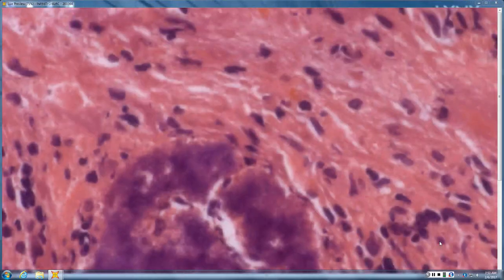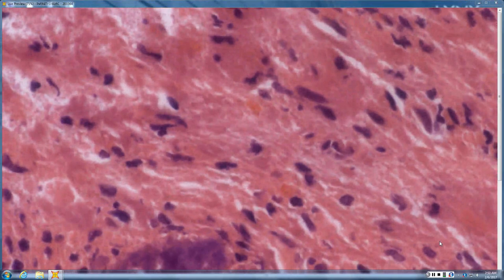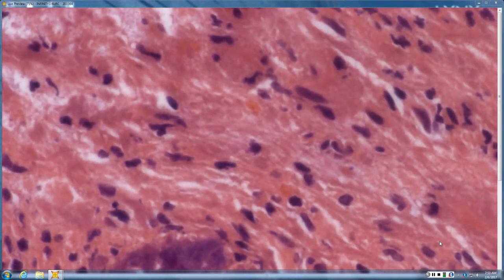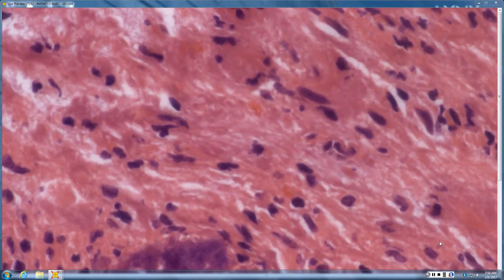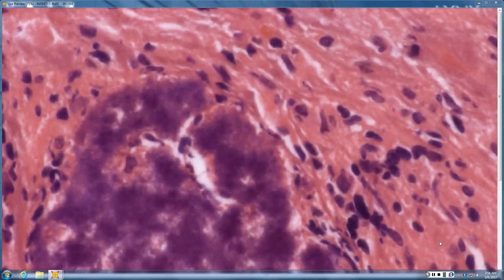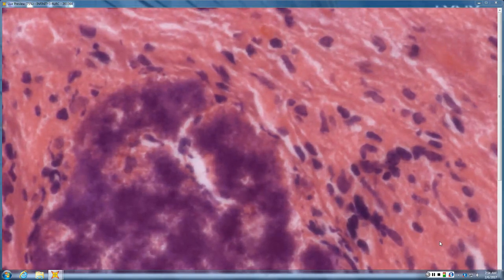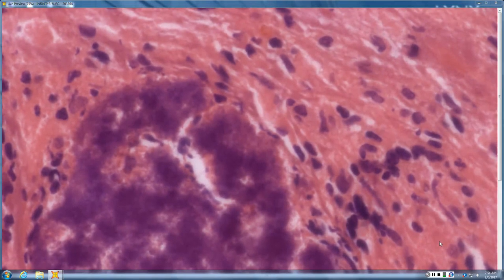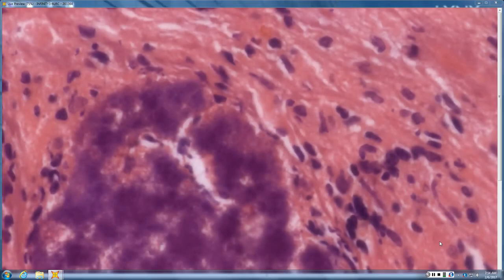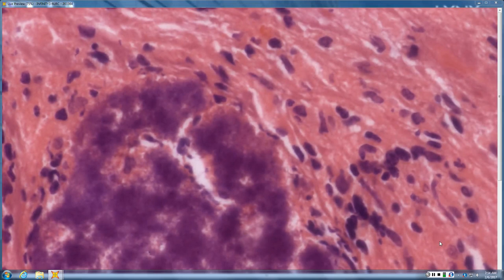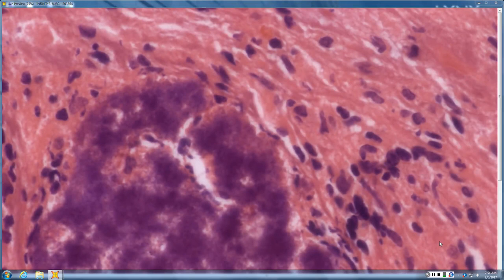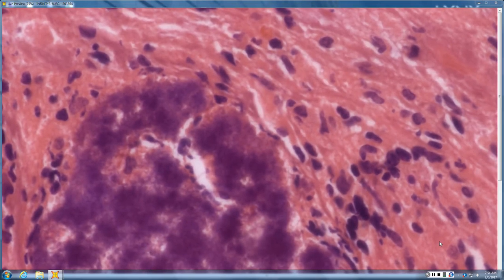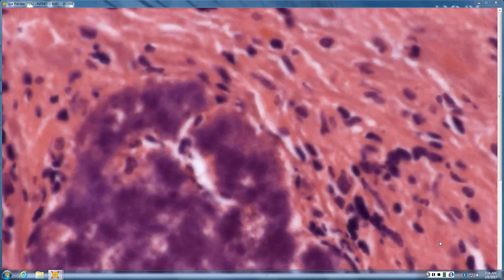This is not made of cocci. It's made of little blue filaments. So what kind of mycetoma, what organisms are likely? So I'm just thinking of the bacterial ones like nocardia and actinomycetoma. Yeah, so it's an actinomycetoma rather than a fungal. Because fungal, you're going to see what look like hyphae. Hollow, clear spaces, right? Okay. This is little thin blue amphiphilic filaments. That's bacterial, filamentous bacteria. So that's going to be nocardia.